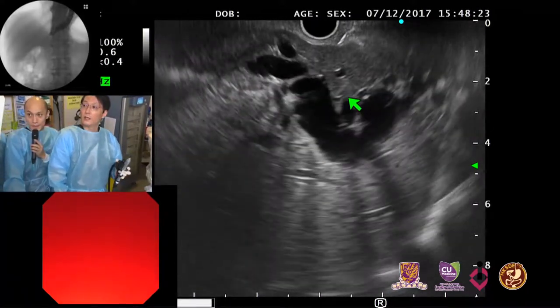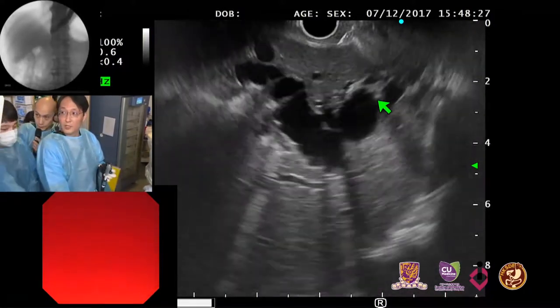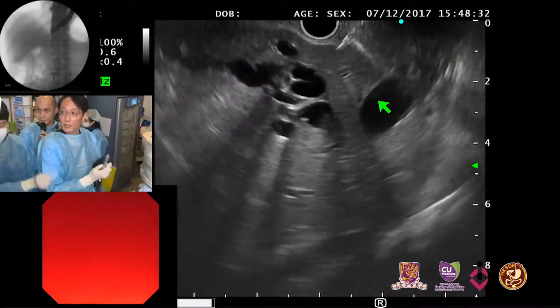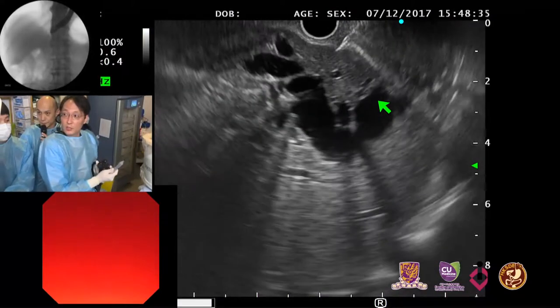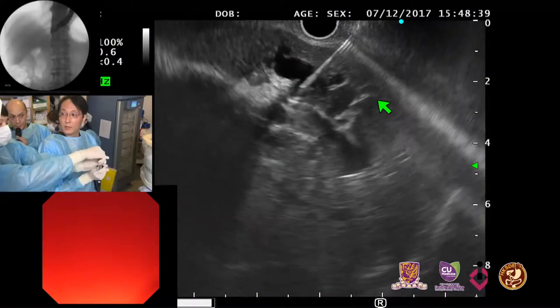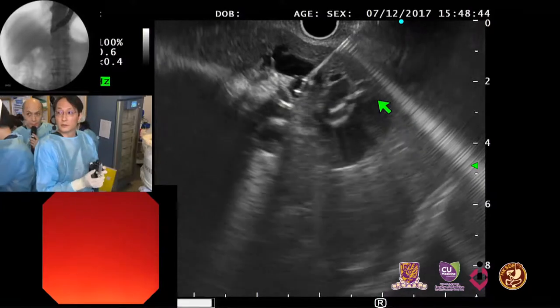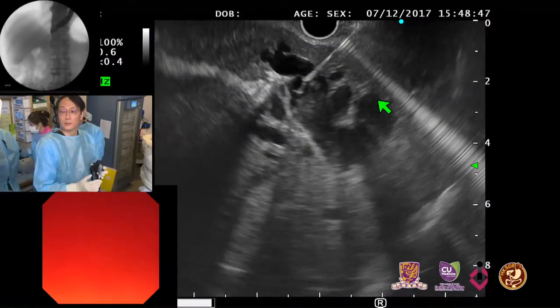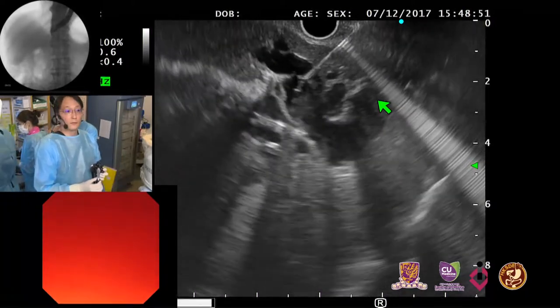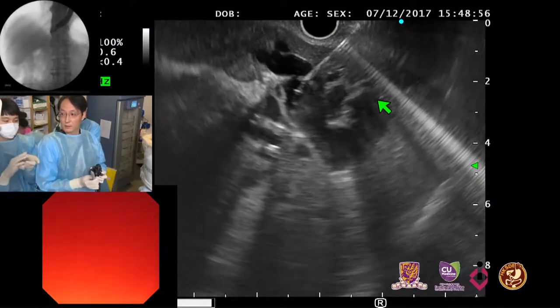This is segment three duct and segment two duct. Do you make a distinction? Basically, I prefer the B3 portion, yeah. But it's sometimes difficult. In fact, there's an intervening vessel there. So I perform the puncture here. Then we check the aspiration first. So usually we prefer B3 because if you puncture through B2, sometimes there's a chance of causing mediastinitis as well. Right. So this duct is very dilated.